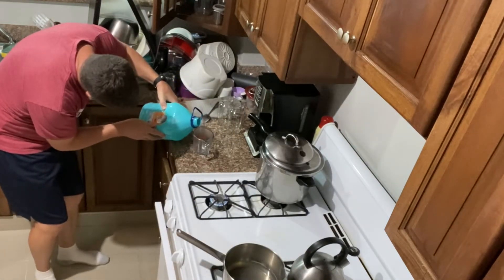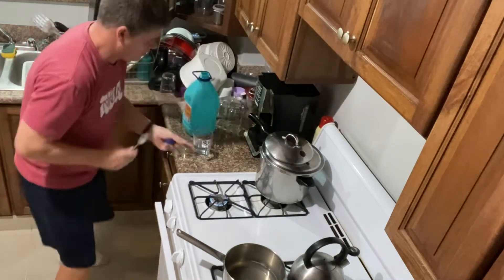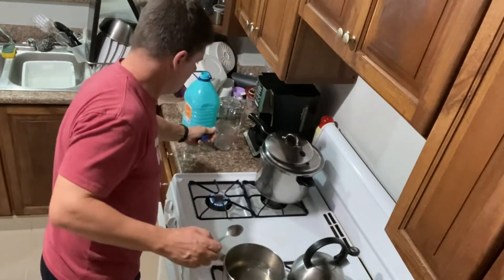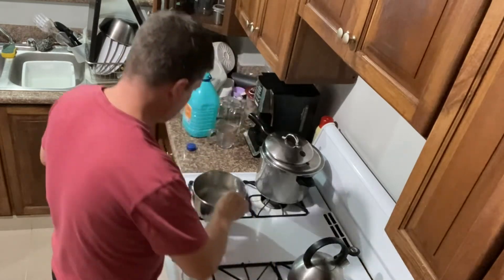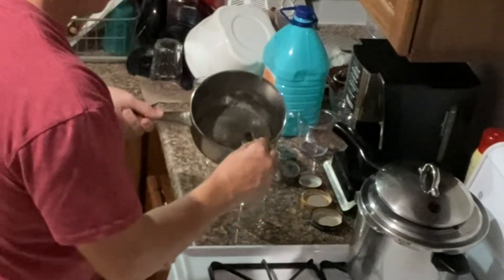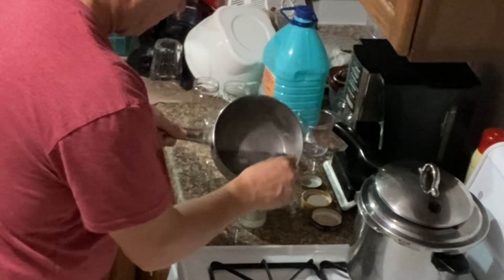After the powder is dissolved in the pot, you add the last 20% of the water and let it lightly boil for five minutes. After five minutes, you add a little bit to each jar and then fasten the lids.